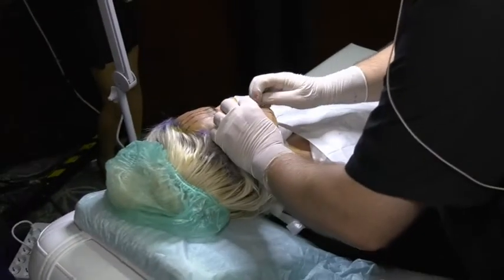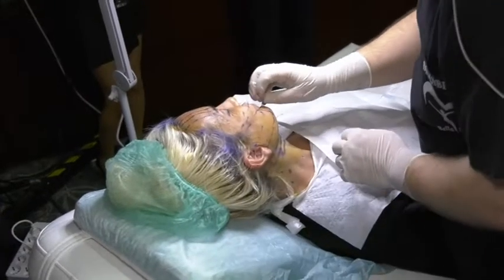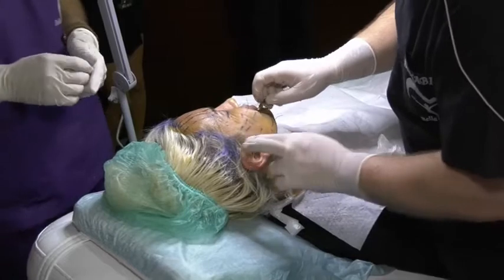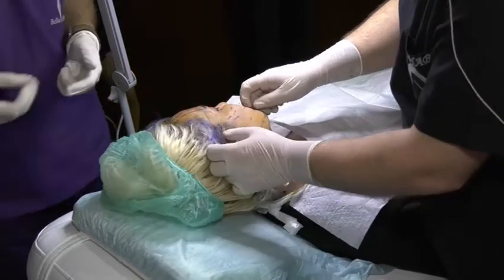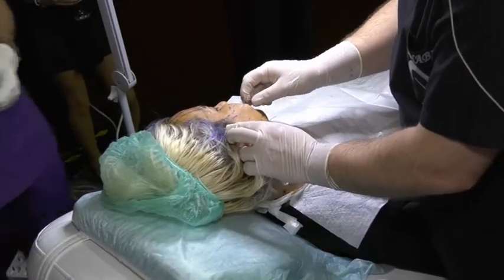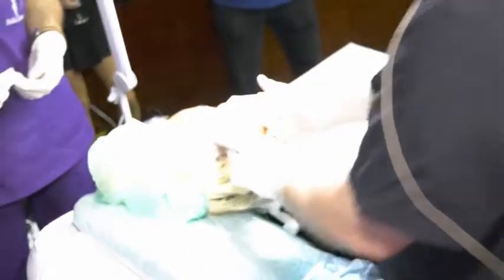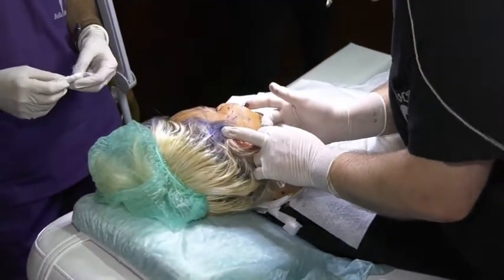Thank you. A little angle and push. A little angle and push. A little angle and push. Look where I am. I am here. Okay? A little angle and push till the end. Look where I am. Here. You see? Here. That's my end. I am already in the temporal zone.